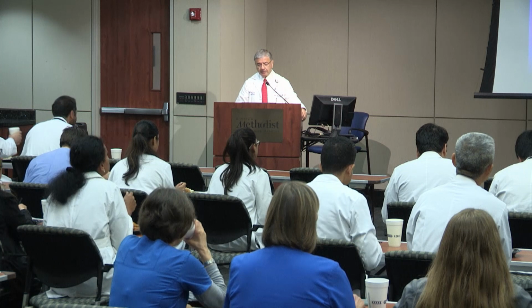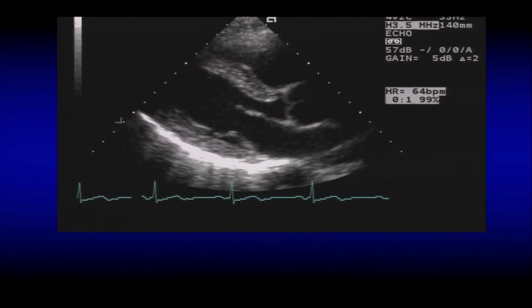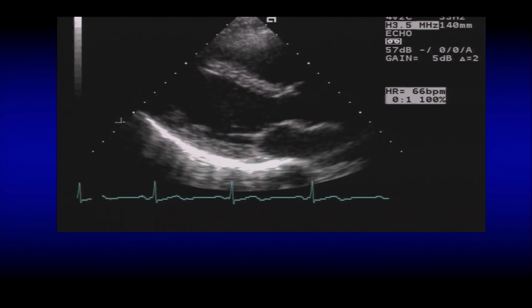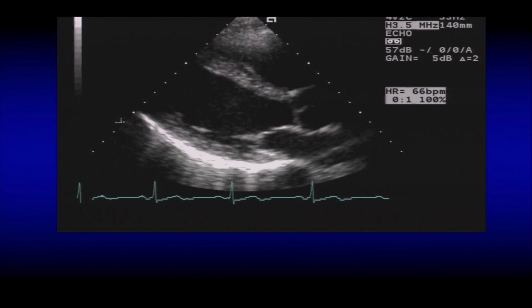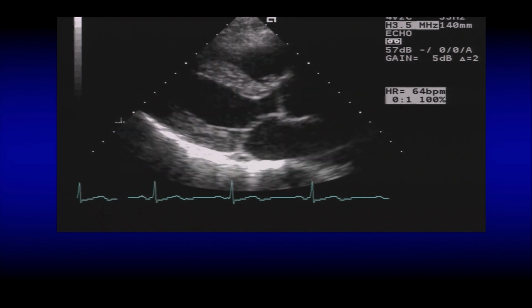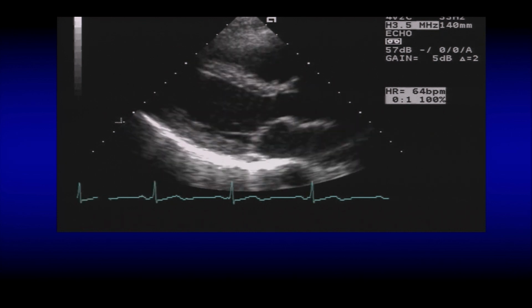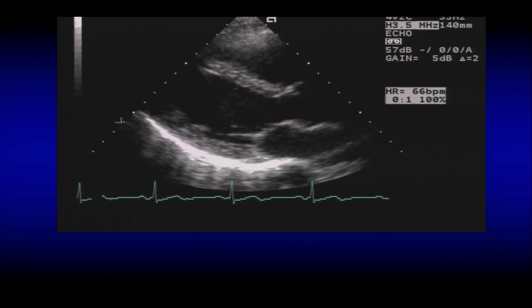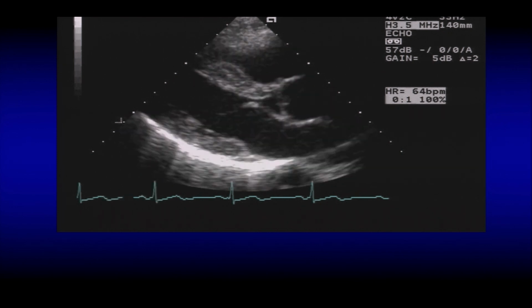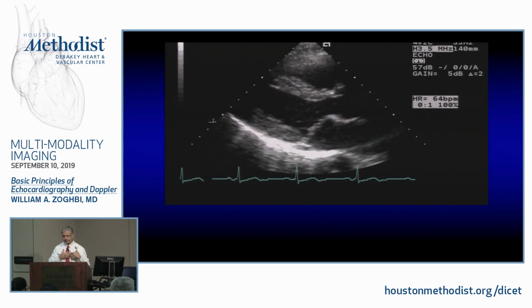Now, how about a 2D? A 2D, well, think of the M mode as being on one line. In a 2D, I'm steering this ultrasound beam into this space. Now, why is it in a 90-degree or so vector as opposed to a linear? Because of the cardiac structure. So we modified it regarding cardiac to be in between the ribs.